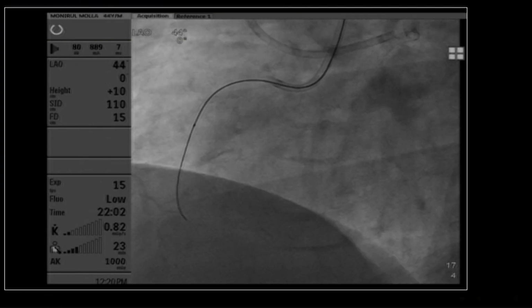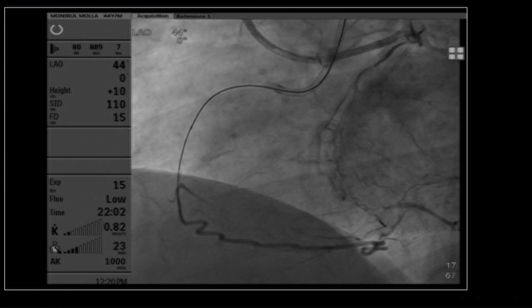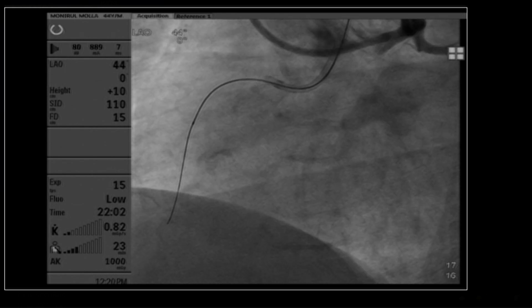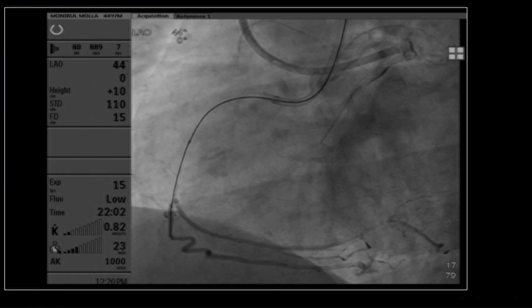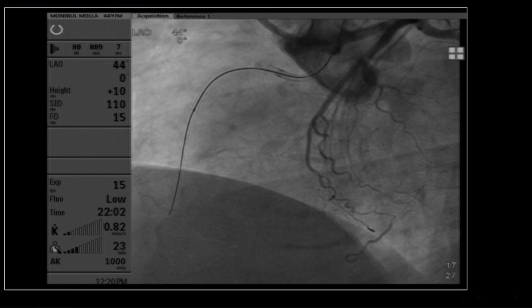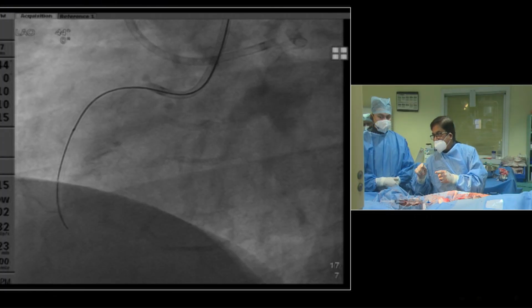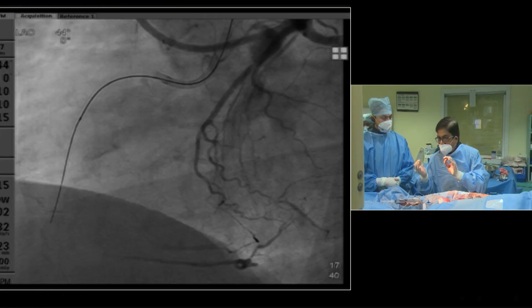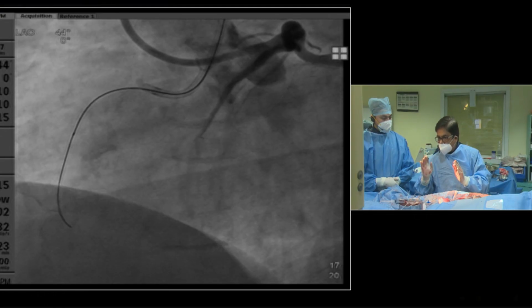If you imagine an artery, after all, it's an occlusion, it's not that hard. When wires go, if I sit at the mouth of the occlusion and push, I'll always push. So that microcatheter I advanced, and then it moved. And at the last point, when the distal cap was there, I was always directing, Pratap caught those directions, he was dictating it. That's perfectly right.